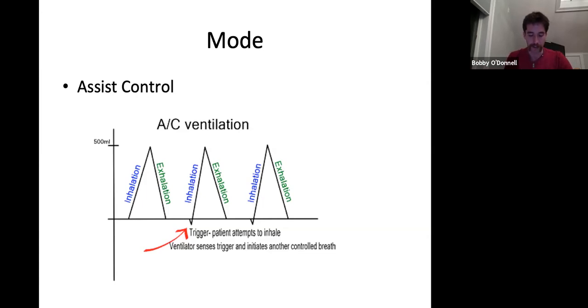That being said, it's really good for those weak respiratory muscles. If they've had built up lactic acid or CO2, this is really helping them relax, and you're doing all of the work for them on this ventilator setting. One of the pitfalls is that in the ambulance, you can cause an accidental hyperventilation because there's a trigger sensor on this. The bumps in the road and the movement can cause the ventilator to think that the patient's spontaneously breathing when they're not. That's something to be aware of as well, that you might need to increase the trigger so you're not getting this air trapping issue.